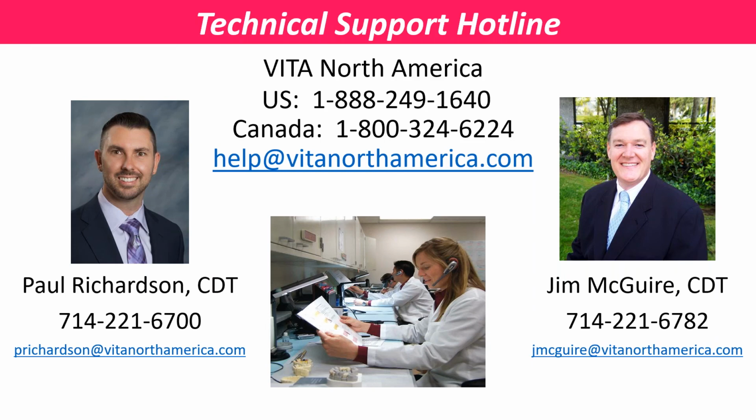Because we're trying to match the shade liquid to an exact shade, like A1, they're not universal, they're individual to the specific product. So hopefully that wasn't too confusing. If you want more clarity, call me or email me. I can send you some literature or show you a couple of diagrams that explain it better.